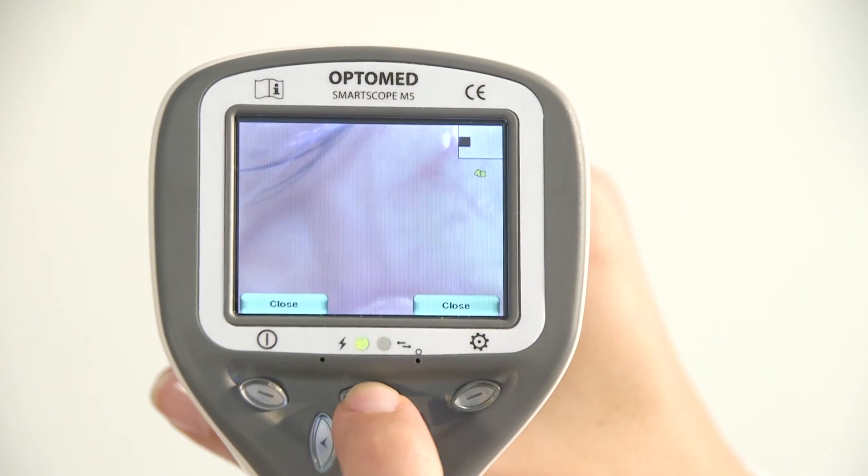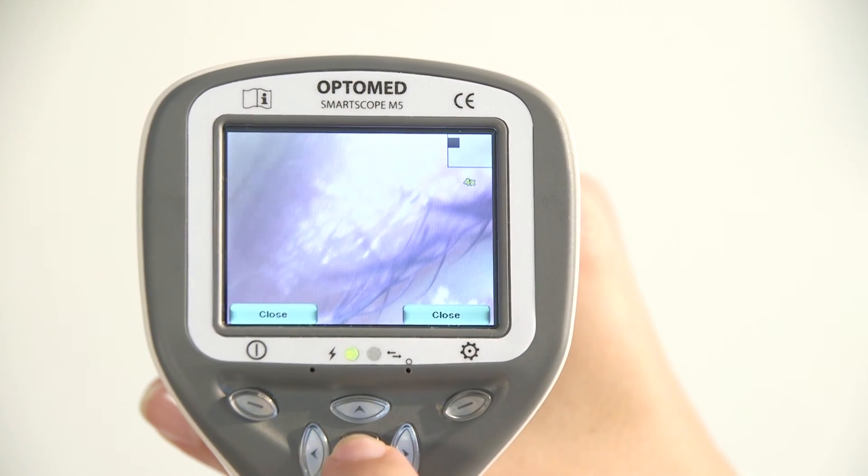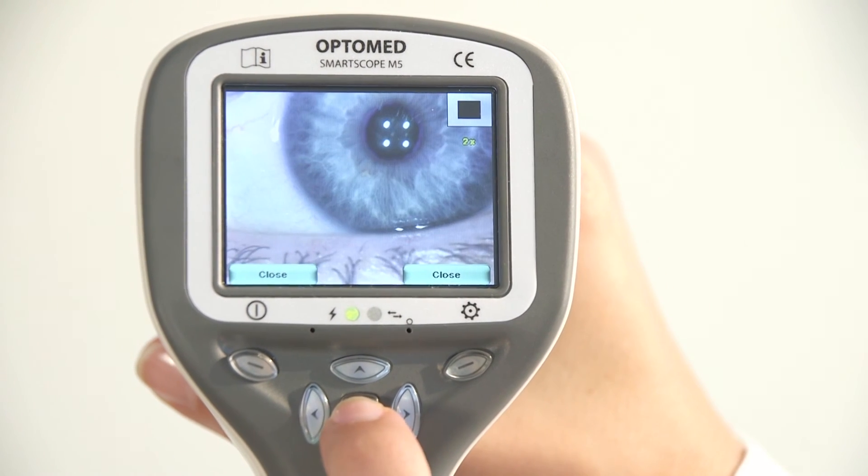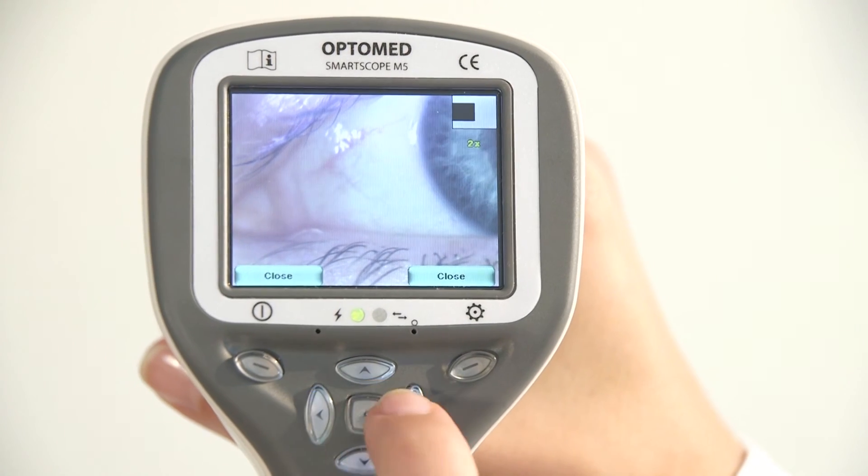The image can be zoomed in the instant preview by pressing the middle key. There are four zoom levels; pressing the middle key activates the next level. Move around the image by using the arrow keys.